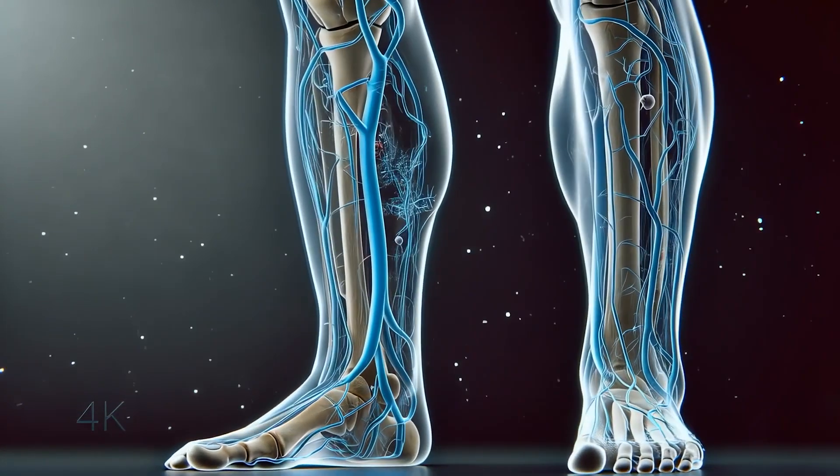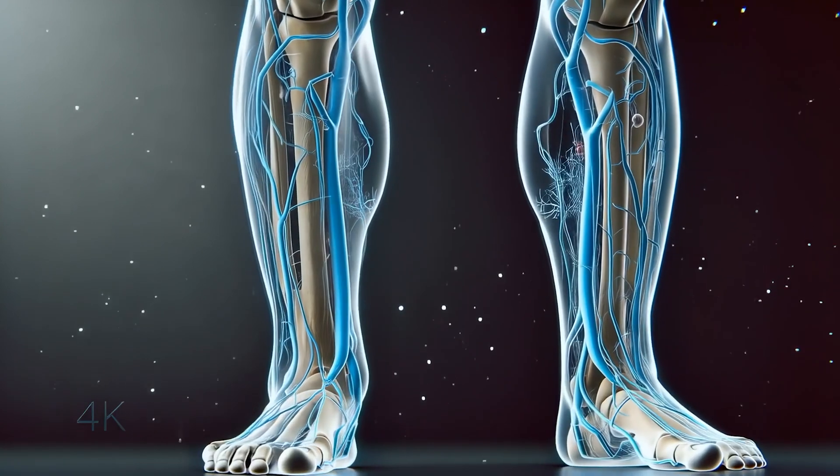Typically, an ultrasound will show a network of veins called deep veins. These are located inside the muscle and they do most of the work to carry the blood out of the legs. Usually, these veins have healthy valves without significant reflux and we leave them alone.